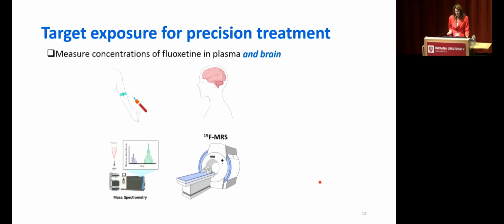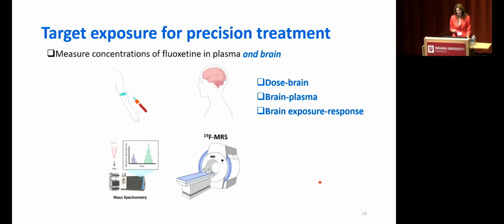And that's where 19F MRS comes into play. And it allows us to answer questions like the relationship between dose and brain concentration, brain and plasma concentration, as well as brain exposure and clinical response.